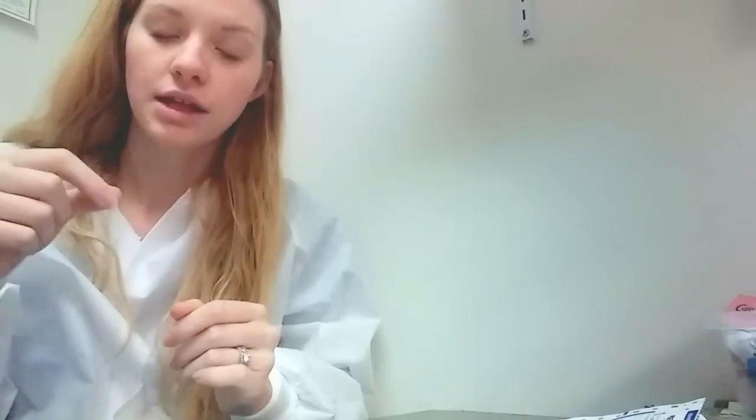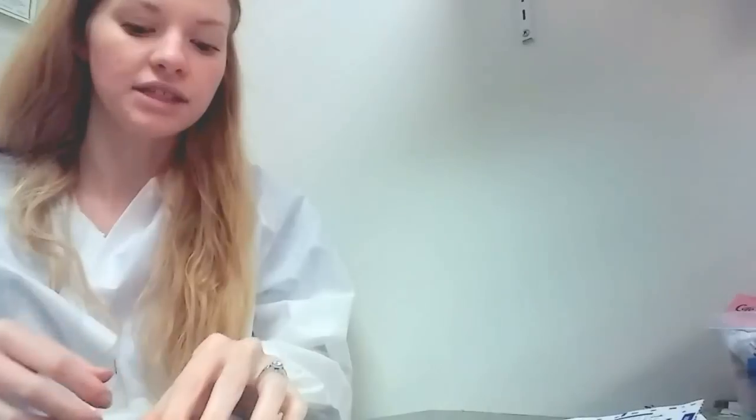And then the person getting the drug screen done will sign, initial and date on the two separate containers saying, hey, I watched them pour off, they didn't add anything, and this is my urine. And they also have to sign the second sheet to say they didn't add anything to it. And then it gets sent off to confirm whatever kind of drug is in it and if the person is on those drugs, if they're allowed to be on whatever it is prescribed or not. So that's pretty much it.